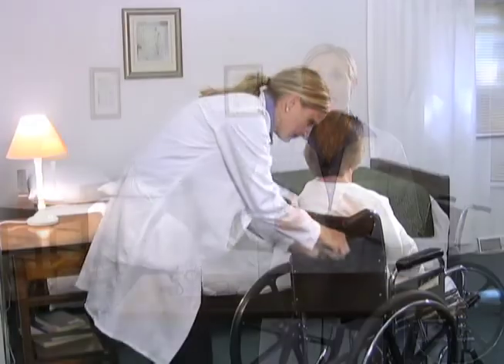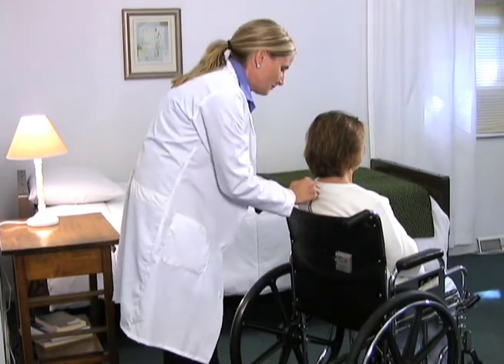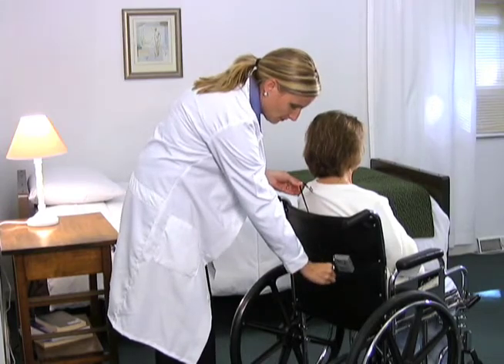Now that you've made sure the alarm is ready to use, mount the alarm to the bed or chair and attach the clip to a part of the patient's clothing that will not likely be removed and that is out of the patient's reach. You can extend the pull cord's length as needed. However, be sure the pull cord will not entangle or choke the patient.